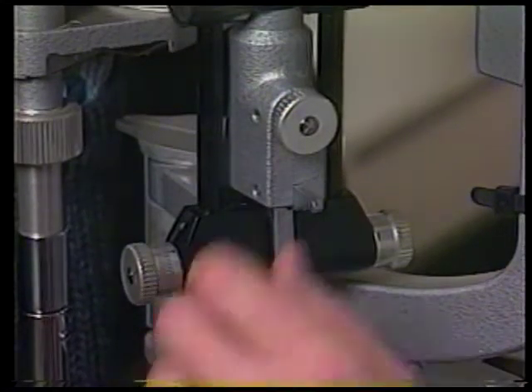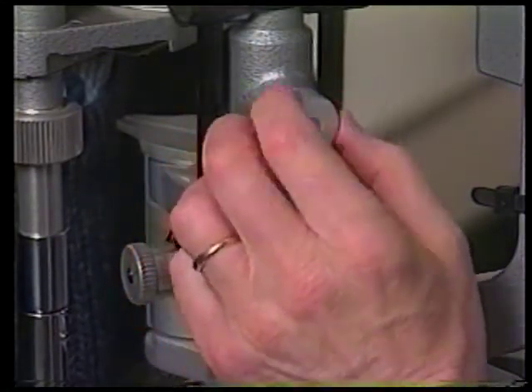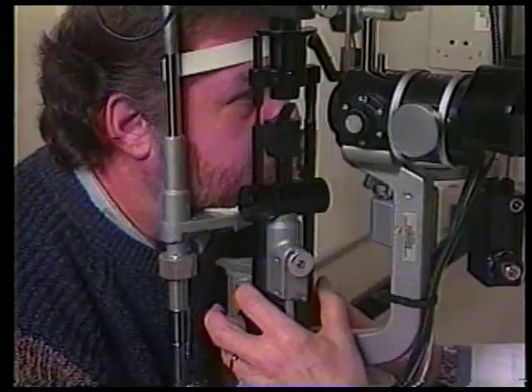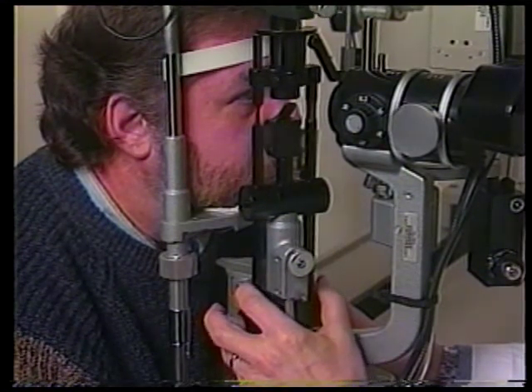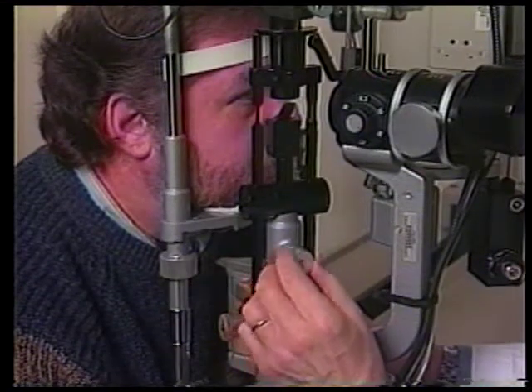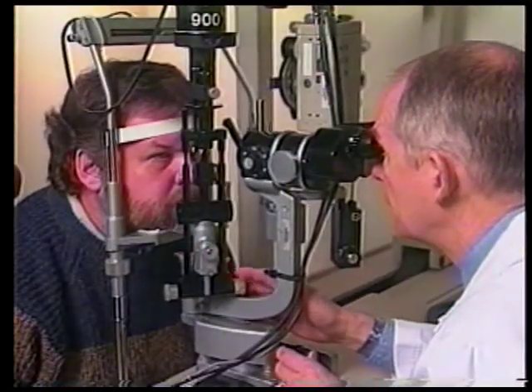To perform sclerotic scatter, you must loosen the centering screw found at the back lower portion of the slit lamp arm. Then the slit beam can be pivoted off its vertical axis to defocus the light from the microscope. Remember, you must tighten this knob at the completion of your sclerotic scatter examination or all subsequent exams will be out of focus.